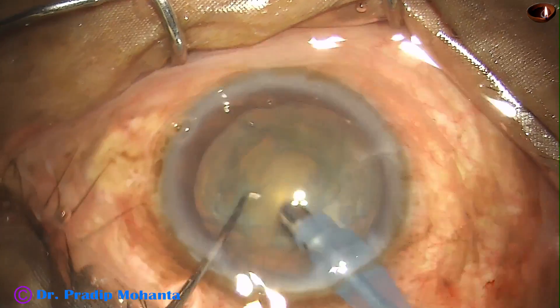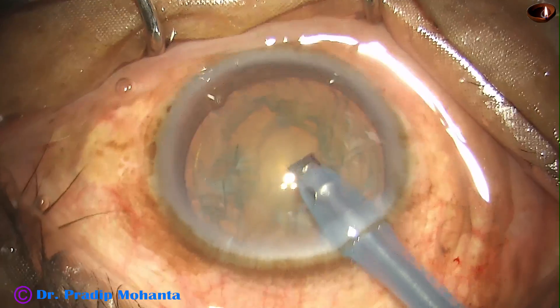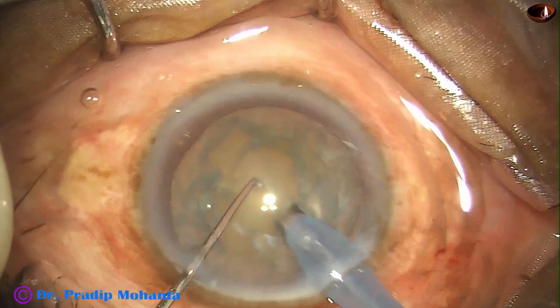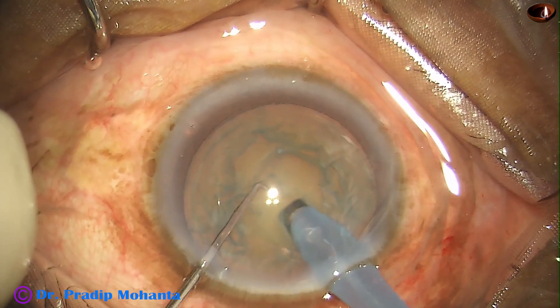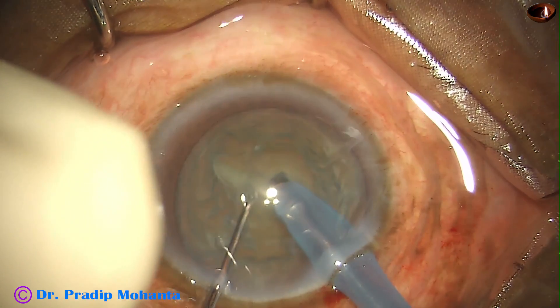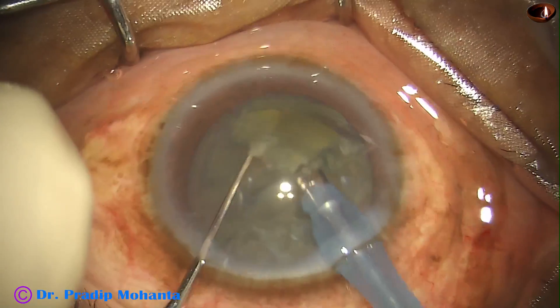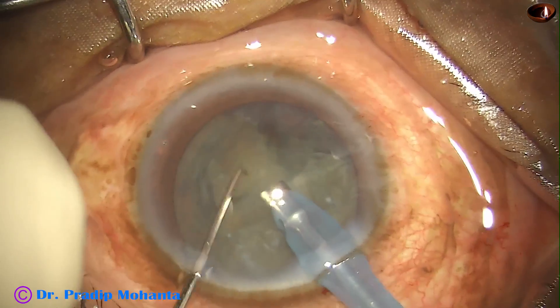After removing some superficial cortical matter, I am going to try mechanical chop in this case. Mechanical chop means you just support the nuclear mass and use the chopper to slice the nucleus. At this moment I am in irrigation and slicing the nucleus — just make a groove, support the nuclear mass with the phaco tip and slice the nucleus with the chopper.